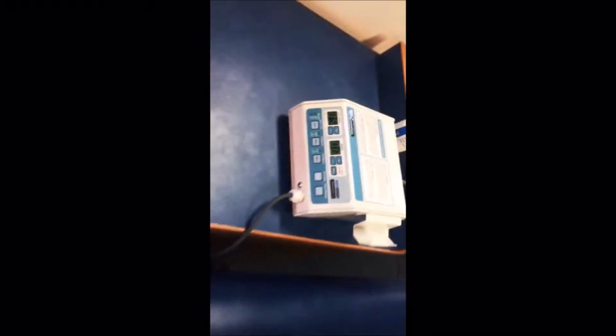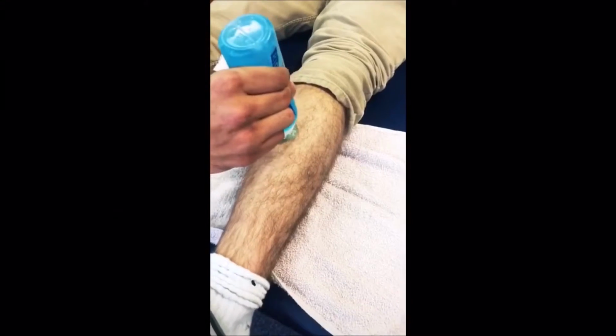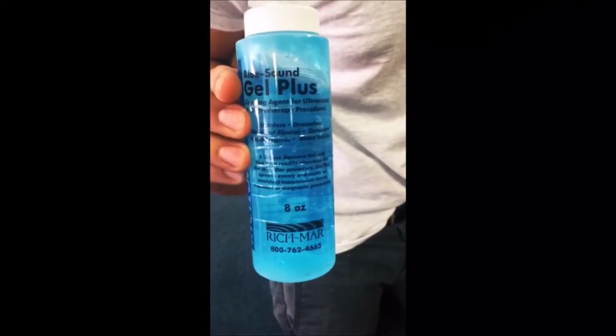Today, we'll be doing a continuous treatment, so it will stay at 100. Remember to keep the intensity at 0 until treatment starts. Apply the gel or medication to act as a medium for the waves to pass through the region. This is the brand of gel we're using.